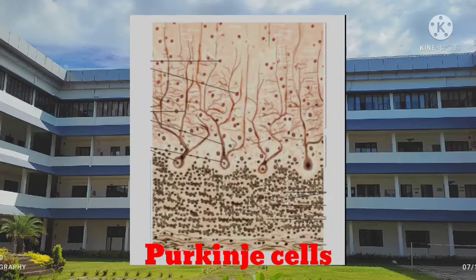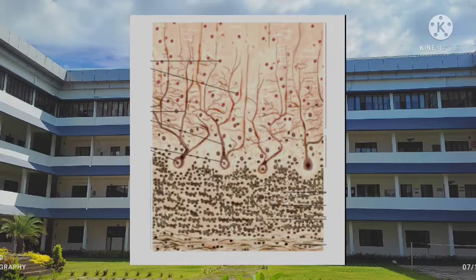The Purkinje cell layer is unusual in that it contains only one layer of neurons. The cell bodies of these neurons are large and flask shaped. The cells are evenly spaced and dendrites arise from the neck of the flask and pass upwards into the molecular layer.